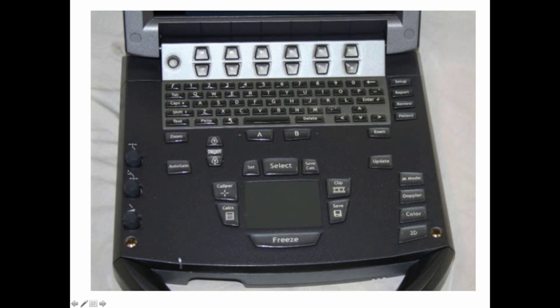These other two you probably won't be using quite as often, but you can selectively change the gain on either the top of the screen or the bottom of the screen, so near gain or far gain. If you ever start messing around with these and get lost in your image, you can always push the escape button, which is the auto gain, which will go to your presets.